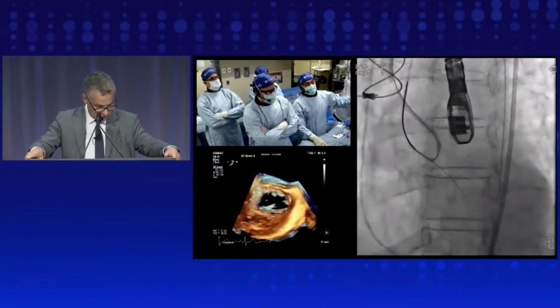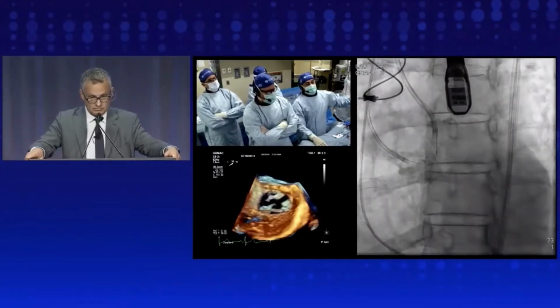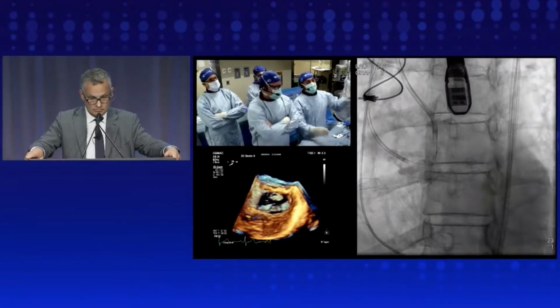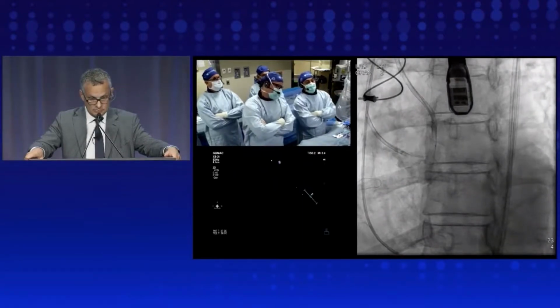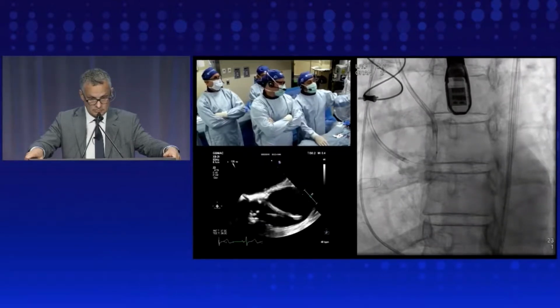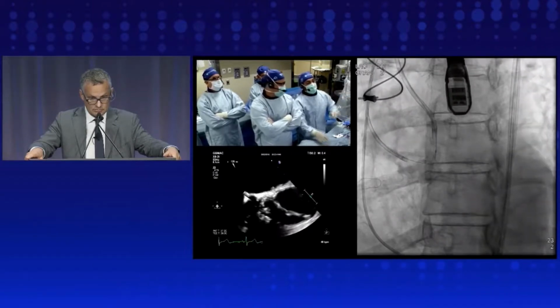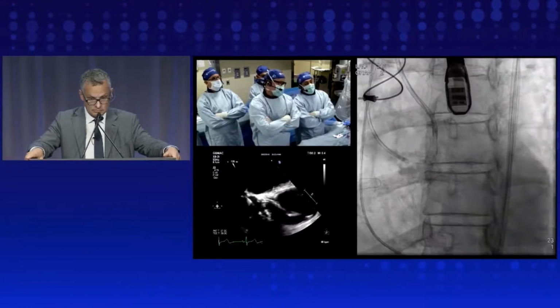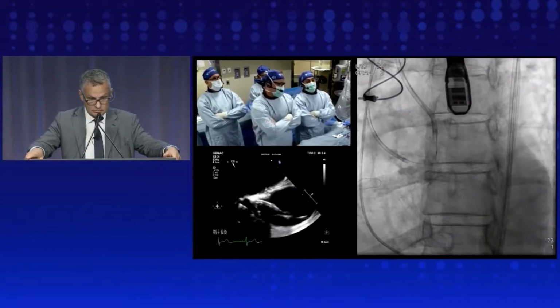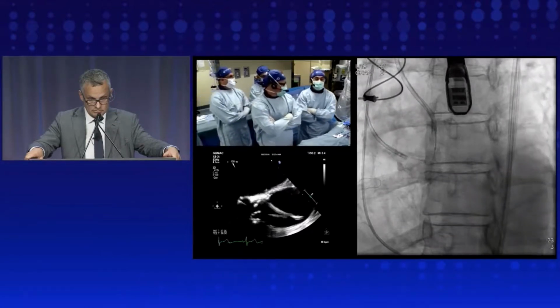And after doing that, we brought back a kinked and denuded wire towards the left cusp. It's just where it enters. The kink is where the leaflet is. Usually we do stronger, smaller curve kinks than this one, but that's a kink that we have for the left cusp. And you can see the AL8 French guide and the multi-purpose guide from both sides. So there is a loop for the left cusp ready to tear and create the laceration of the left cusp.